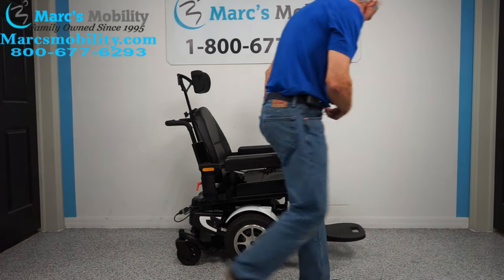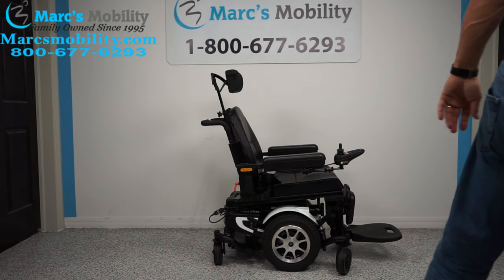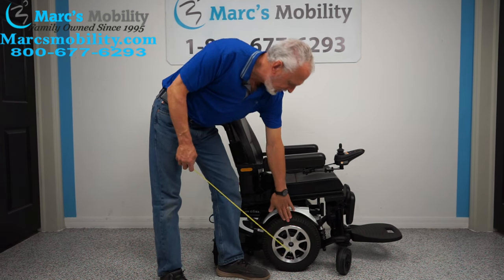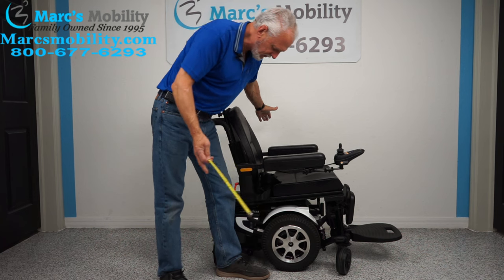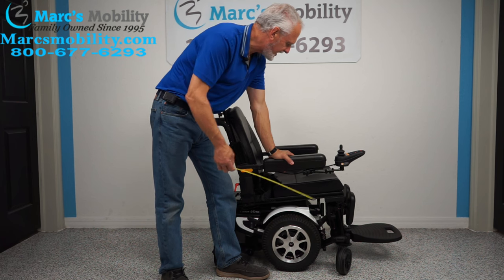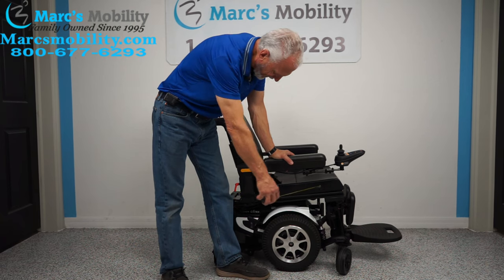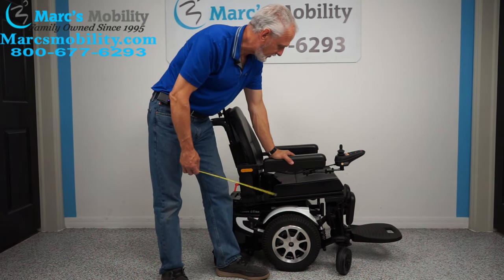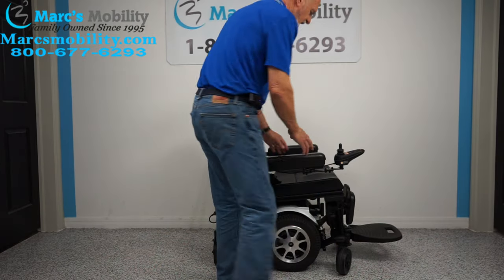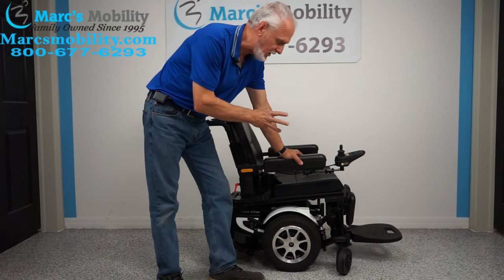A couple of things about this chair: the chair is 24 inches wide. The width from arm to arm is 26 inches — the arms are wider than the wheels. From outside arm to outside arm, 26 inches is your magic number. We cannot make them less or more — they're screwed into the frame. This chair has a 300-pound weight capability. It has a big seat, but the maximum weight capacity is 300 pounds.